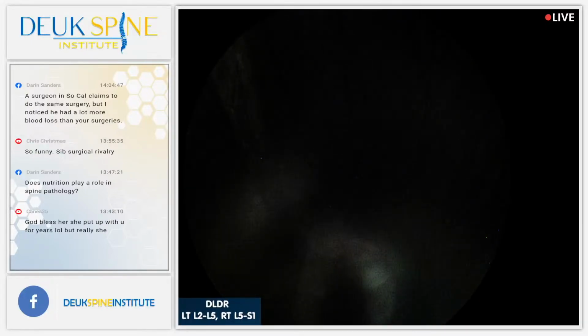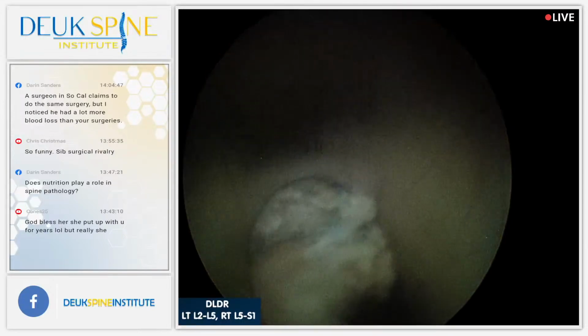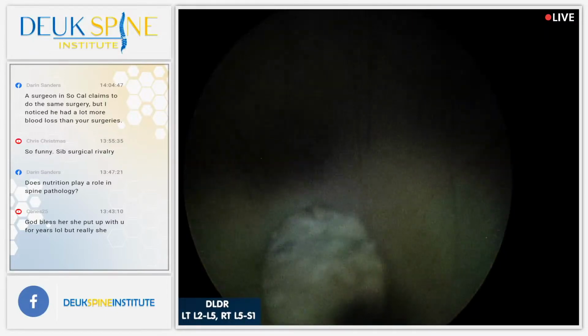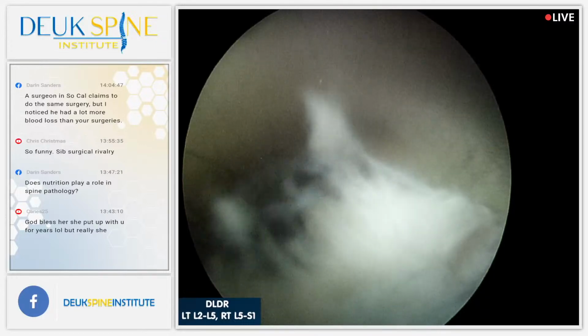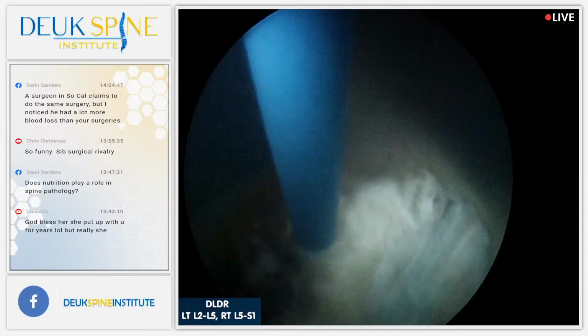All right, that's it. It's kind of nice having something to talk about because then I don't have to think about this surgery. I'm going to get a little bit more of that annular tear right there, and then we're done. At this level, we've got 2 more to go.